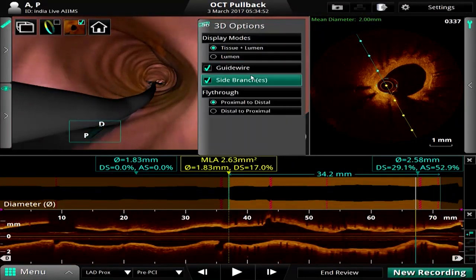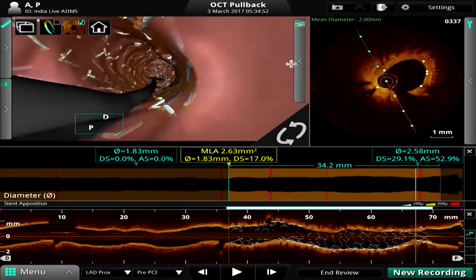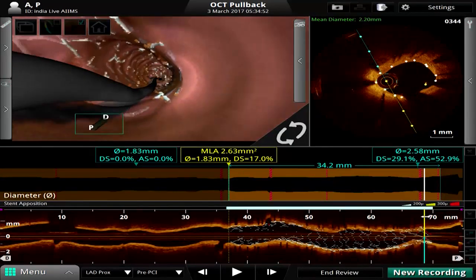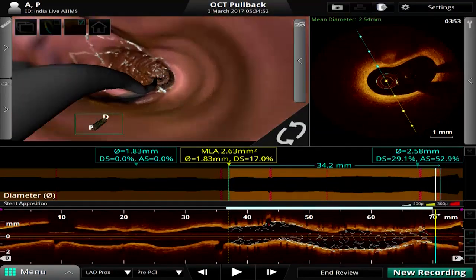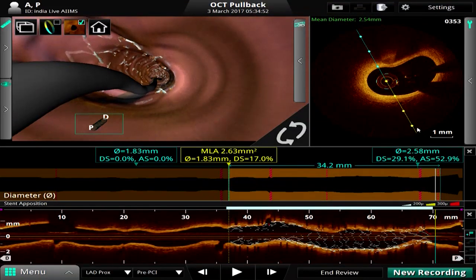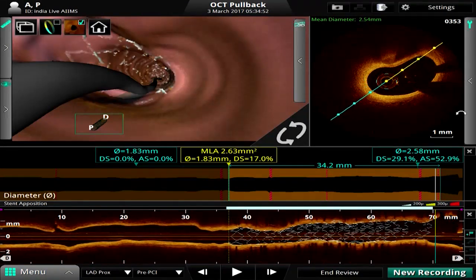So there is a stenosis of the ostial circumflex, which in my feeling is probably related to the stent placement. Maybe it's not, because he was asymptomatic for 2.5 years. He only developed symptoms in the last 6 months. So maybe it is recent, not immediate.